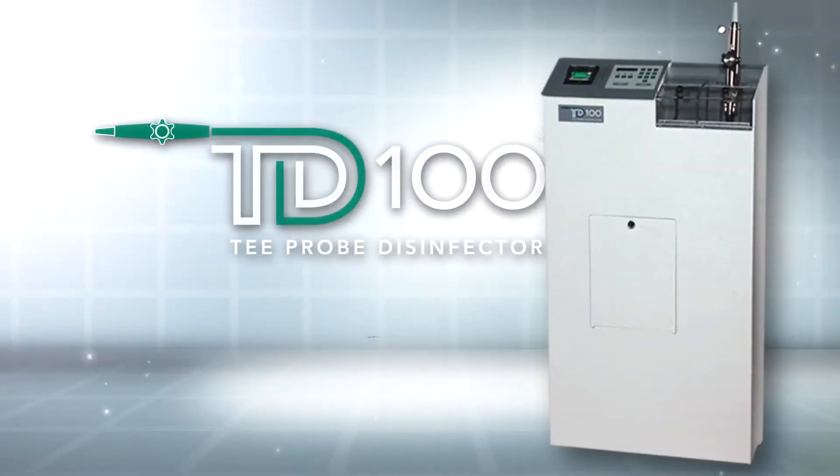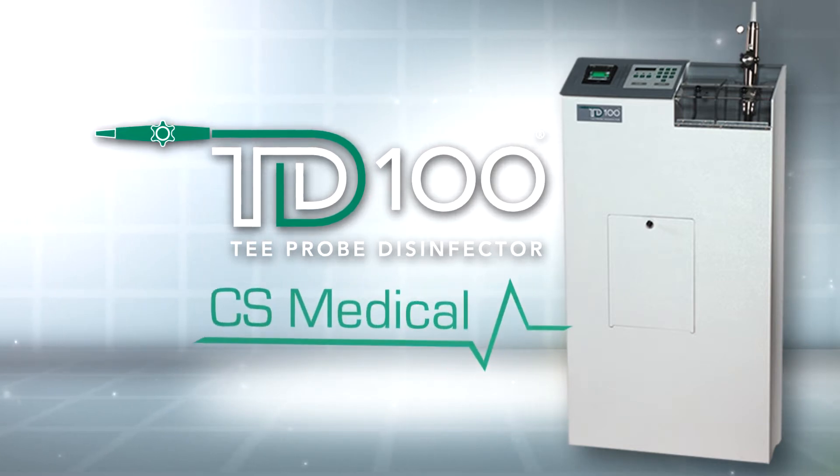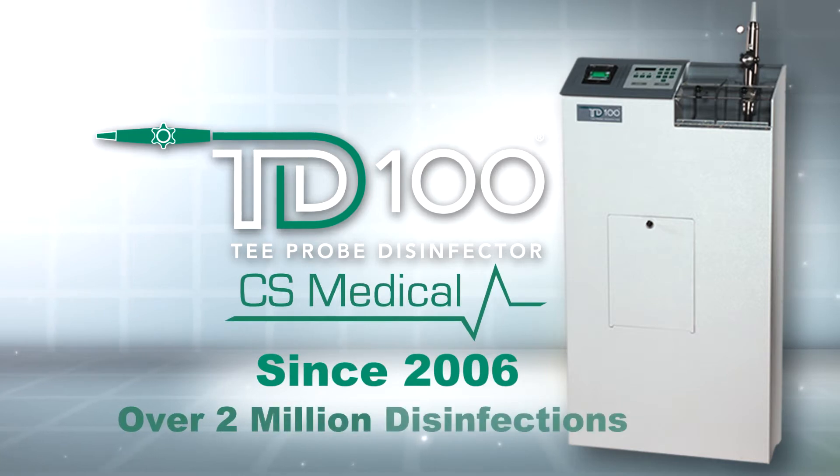The TD100 validates that each of your TEE probes receives the same disinfection and rinse each time. CS Medical's TD100 is the first automated reprocessor for TEE probes in North America. Since 2006, the TD100 has successfully completed over 2 million disinfections.